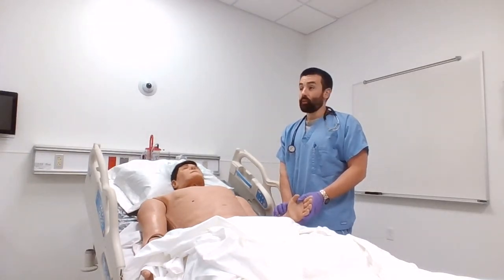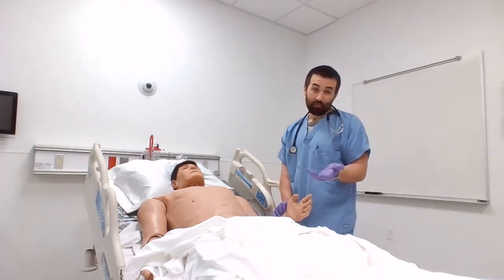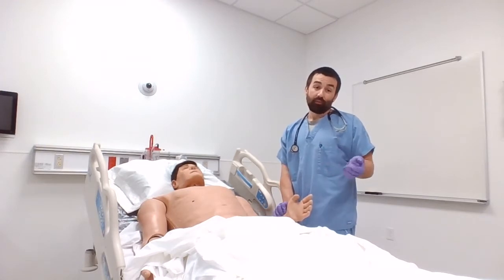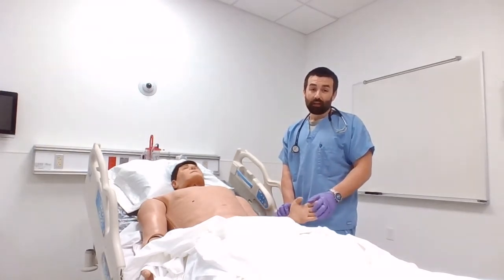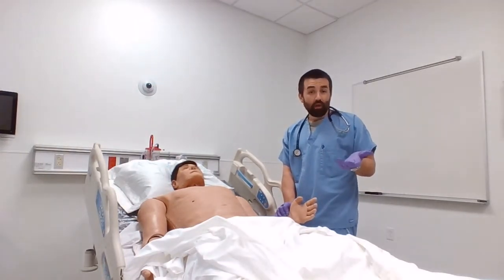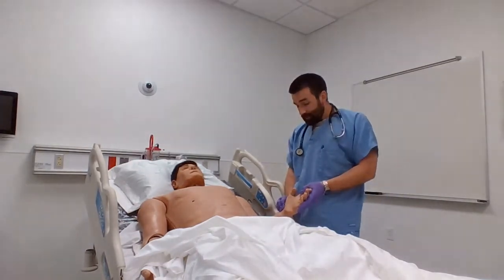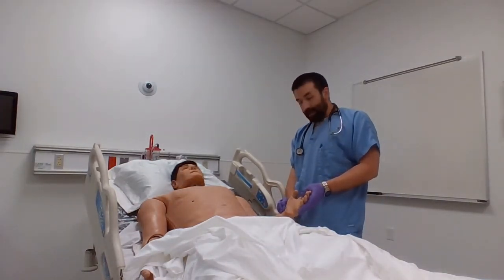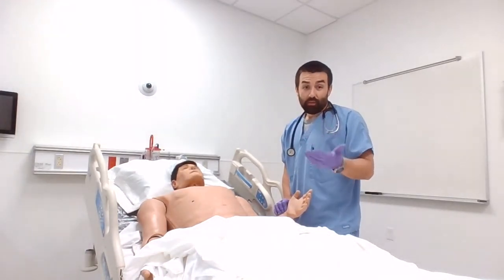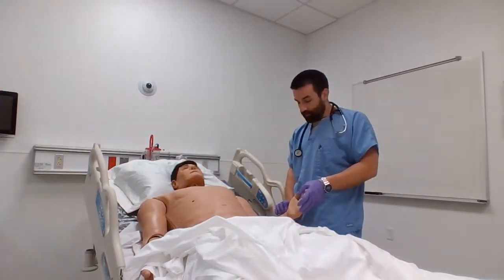Sometimes you've got to roll your fingers back and forth — you don't want to apply it too firm. What I'm going to do is count for just 15 seconds. If it's a regular pulse, multiply it by 4. If it was irregular, I would have to count for a full minute; otherwise my number would be incorrect. The longer you count — if you count over 30 seconds and multiply by 2 — that's more accurate. I'm essentially palpating. He's got big bounding pulses, so I'm feeling the rate, the rhythm, and the strength — that pulse pressure.